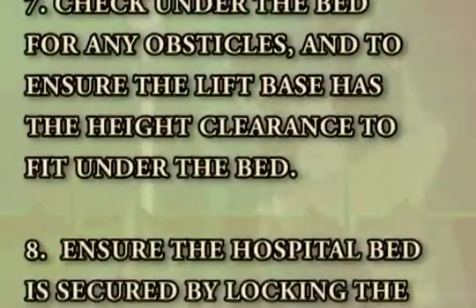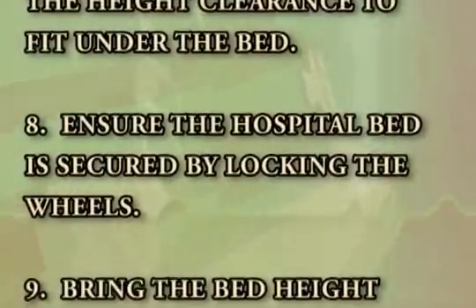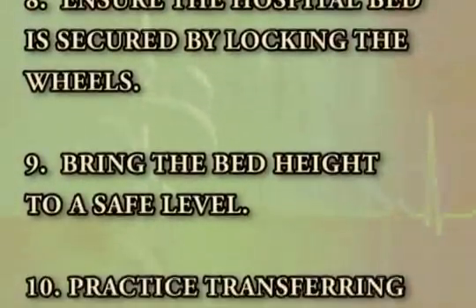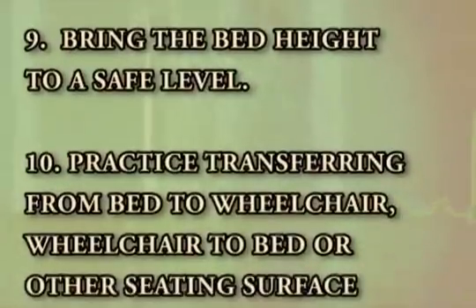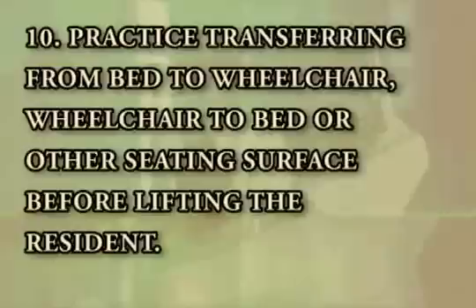the bed. 8. Ensure the hospital bed is secure by locking the wheels. 9. Bring the bed height to a safe level. And 10. Practice transferring from bed to wheelchair, wheelchair to bed, or other seating surfaces before lifting the resident.